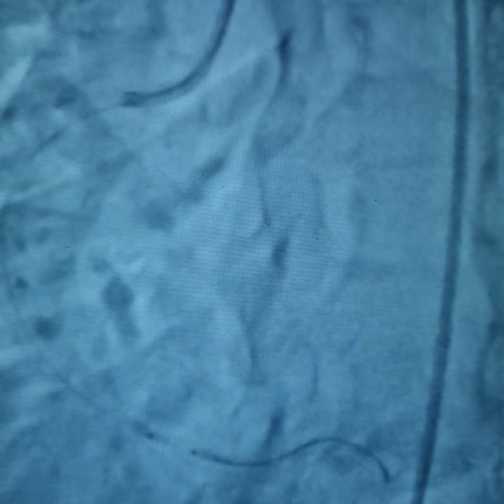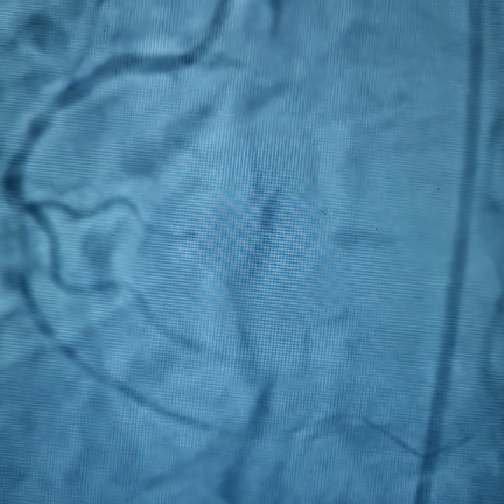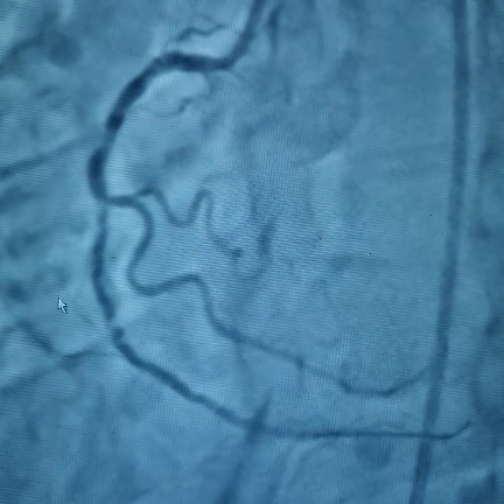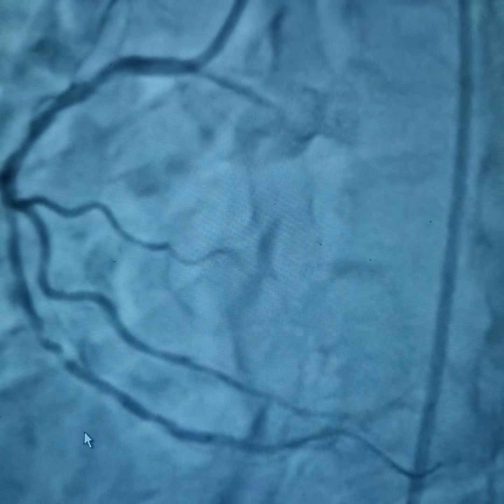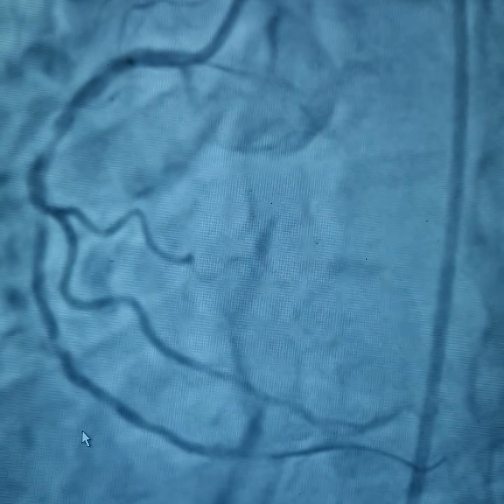We're using a 2 by 12 mm balloon. This is a semi-compliant balloon, and we've inflated it at 8 atmospheres of pressure. Now we can already see some concertina effect right here in action. You can see nothing to worry about because we already have the cine without the wire anyway.